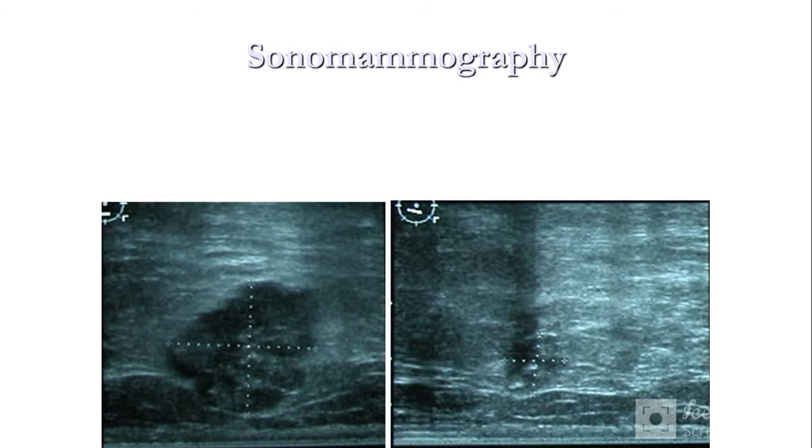And this is sonomammography. With sonomammography, we differentiate the cystic structure from the solid structure. These are the pictures of sonomammography.